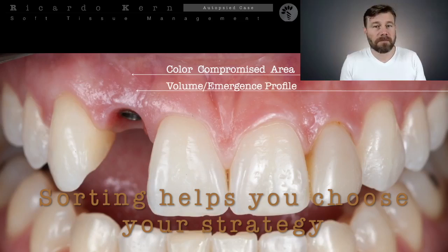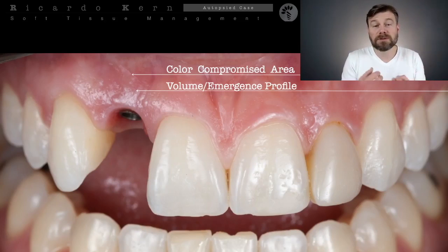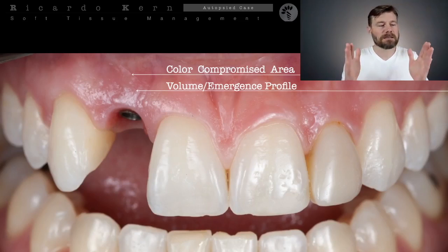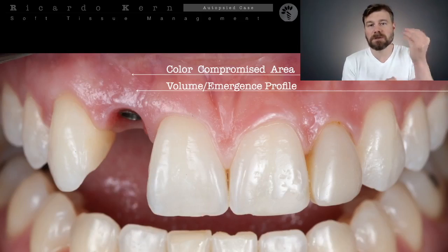Another common problem is the lack of volume or the loss of volume. As you know, for many years when you have the implant in place, according to the way we preserved the socket, with immediate implant placement or a healed site, as time passed, we lost some of the volume. And what happens is that we don't have the proper emergence profile for this crown.